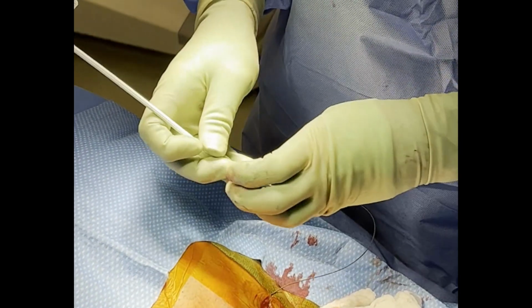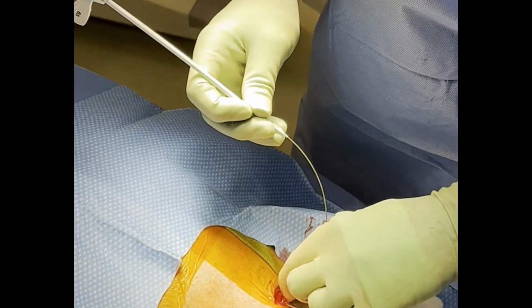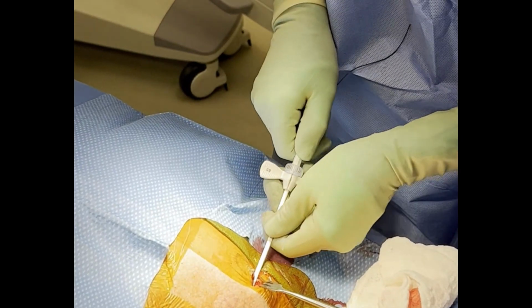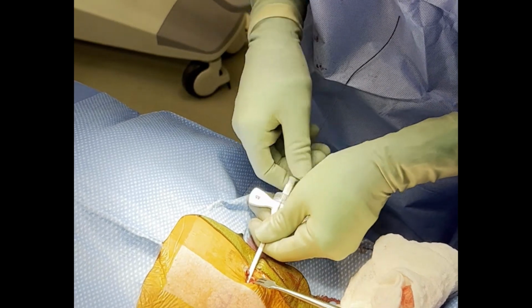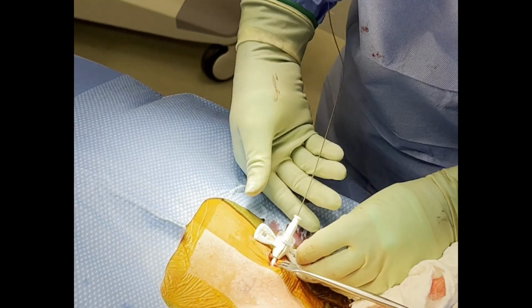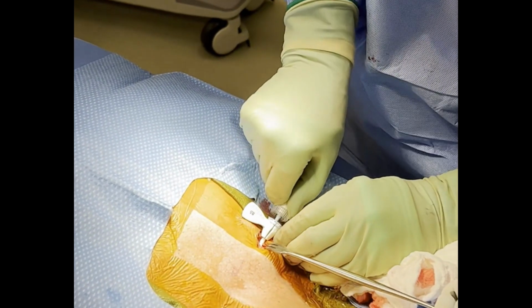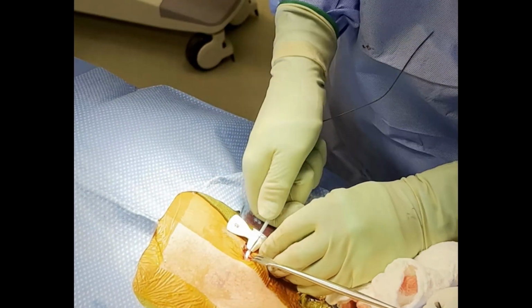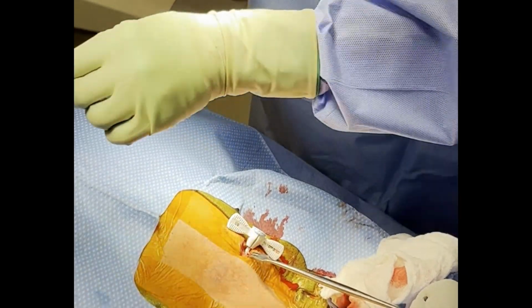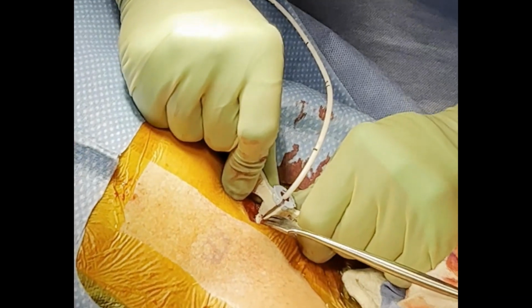Grab the dilator and sheath and advance it along the guide wire in its original trajectory into the vein. Once in place, unscrew the dilator and remove it along the guide wire. Advance the catheter through the sheath, and once inserted, you can remove the sheath.